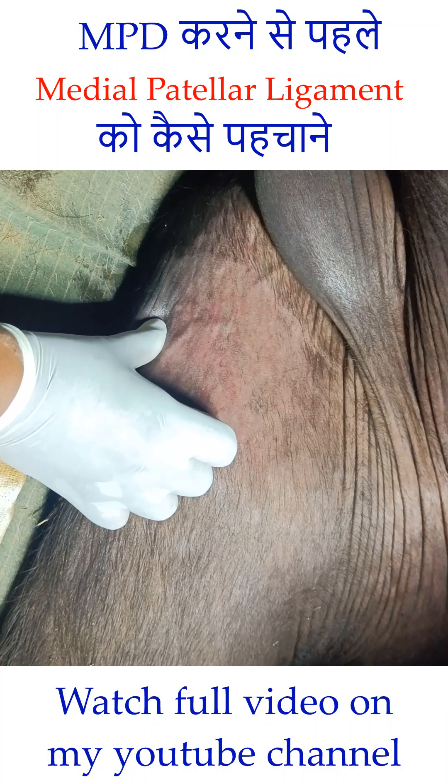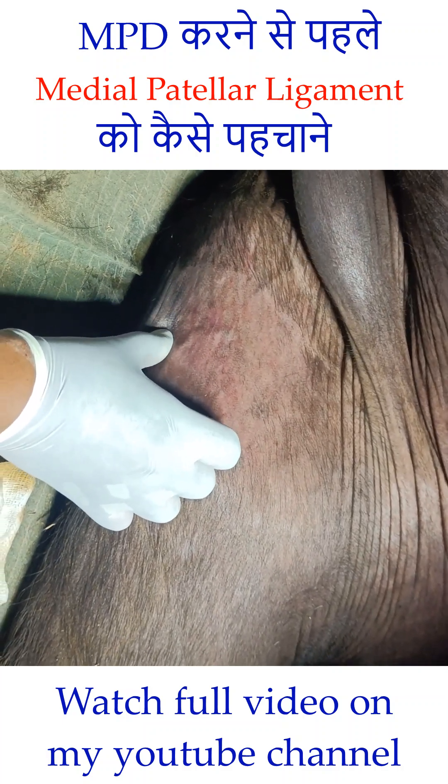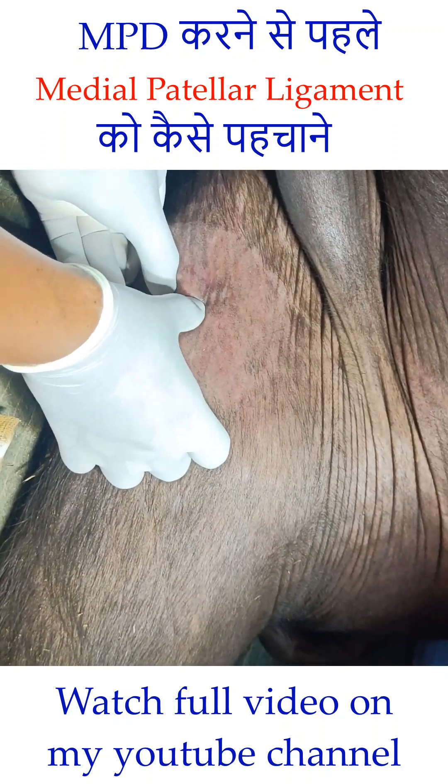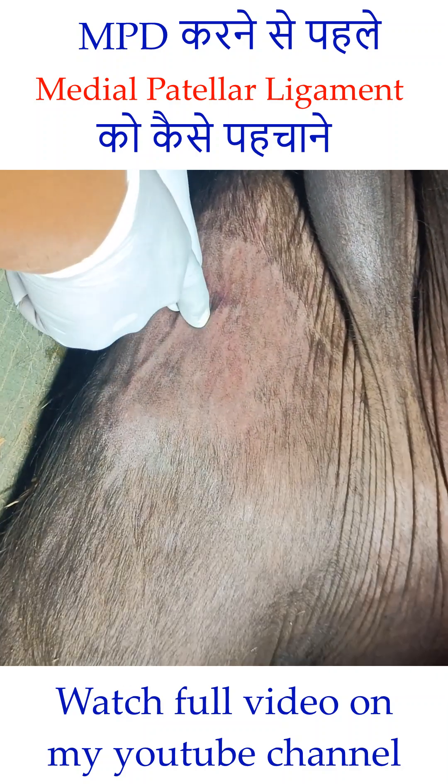We should not cut this ligament anyhow. Otherwise, the animal will not be able to stand or bear weight on this limb. So, insert the blade from here — this tough structure is the medial patellar ligament.